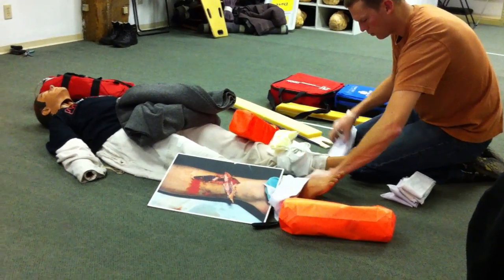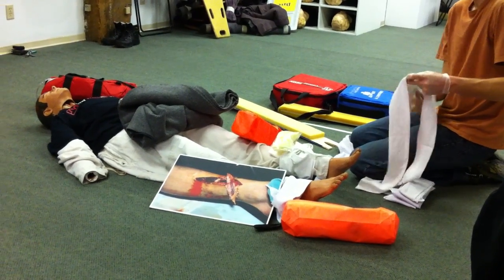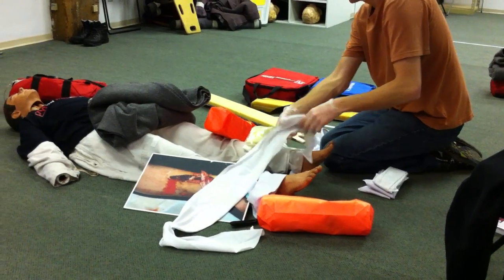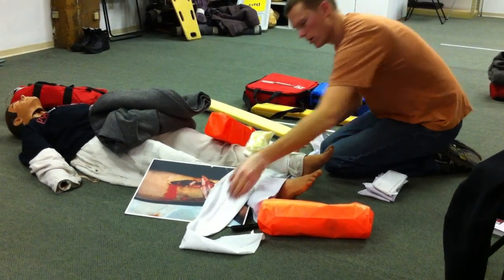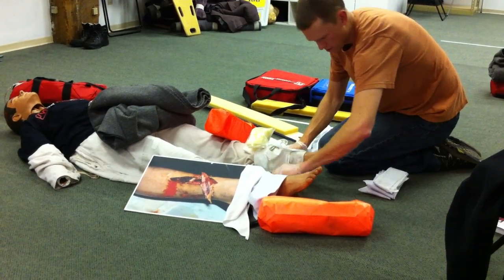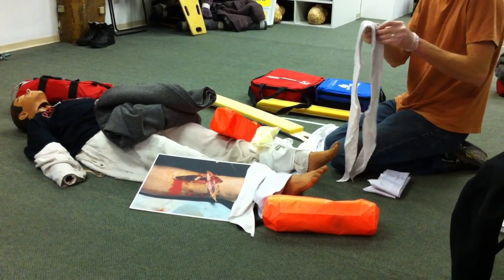Okay, so we want one down here at the ankle. Ideally one below the break if possible. And above the break.